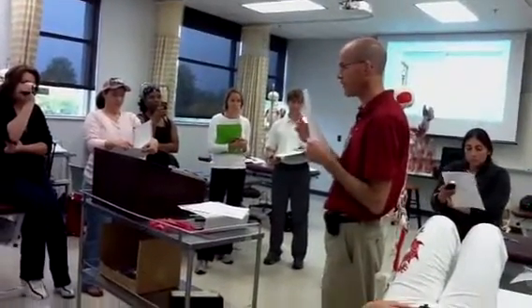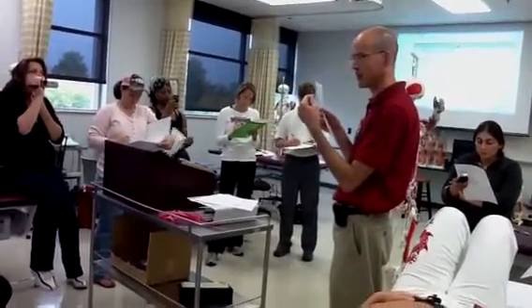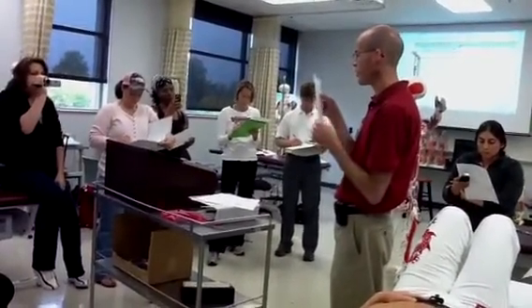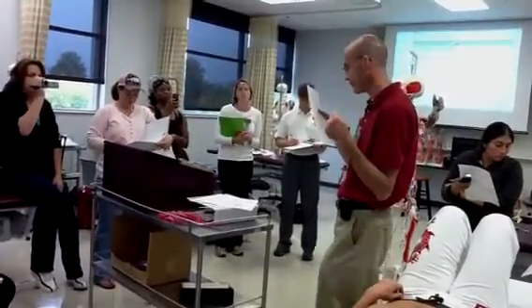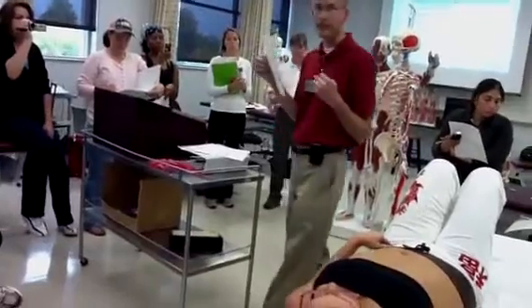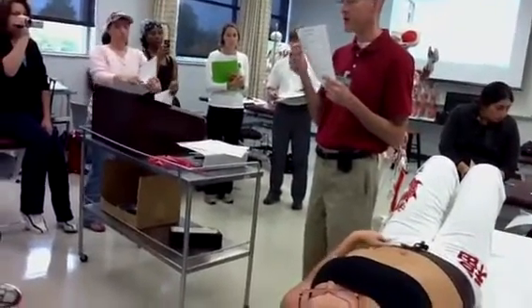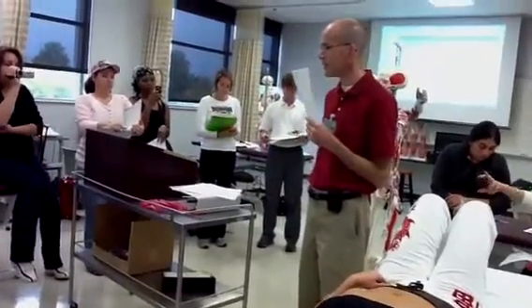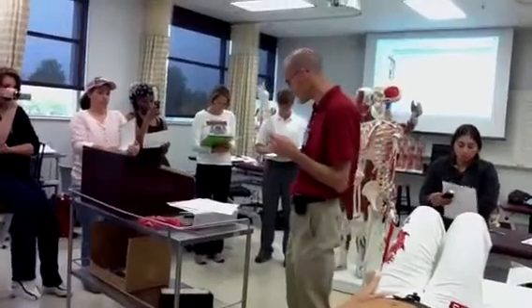All I'm looking for here is 0 degrees to 97 degrees. We've got shoulder flexion written, so 0 to 97 degrees. We don't have to specify right or left. No, you're going to do that in the note that you're going to write. Right here, I just want to know the goniometric measurements. So 0 to 97 degrees.